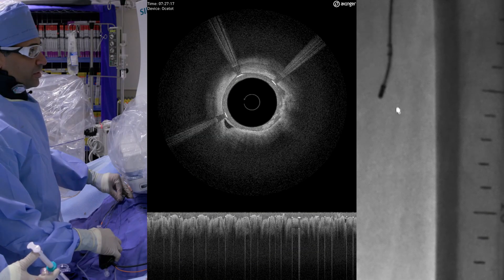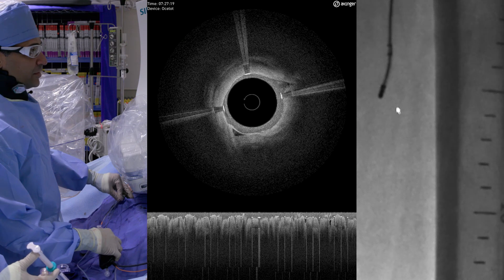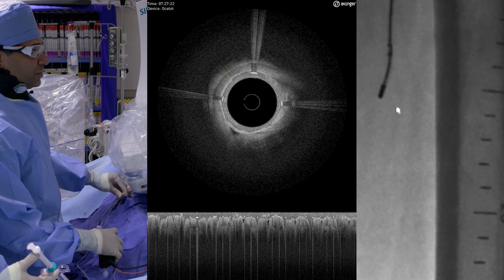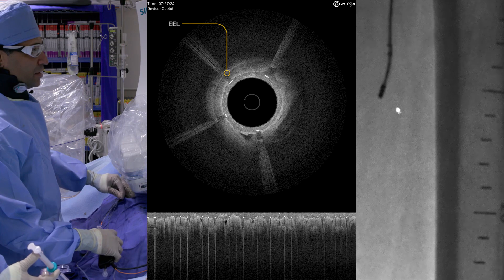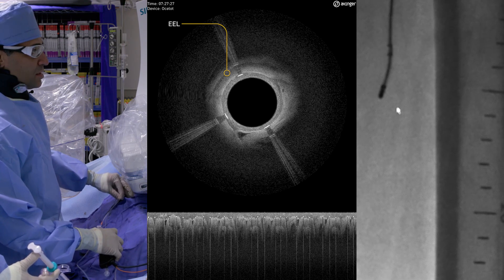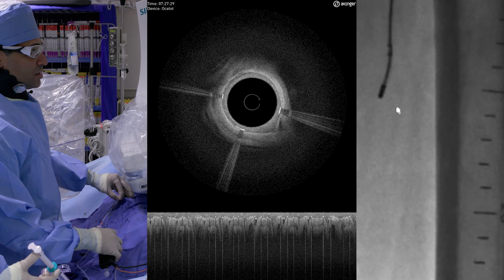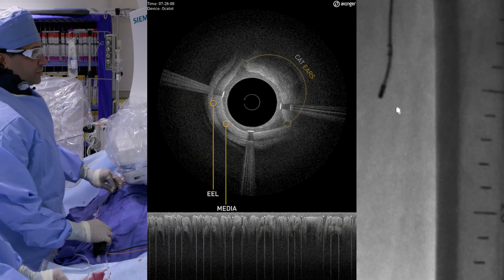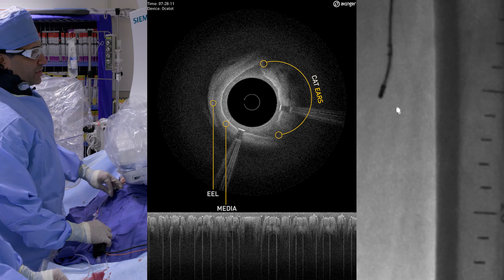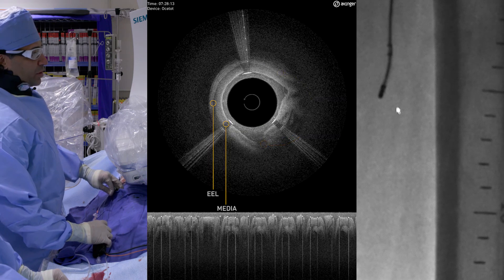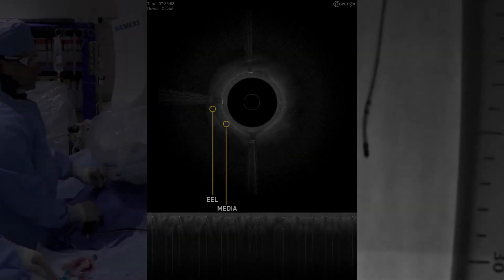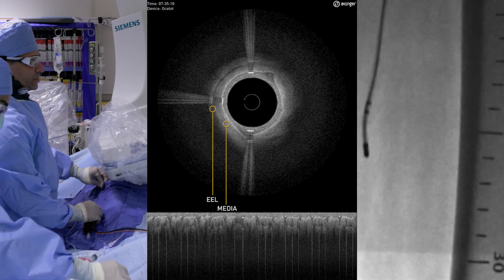And I'm slowly advancing. There's our line there at 9 to 12. I want to keep away from that. That's a beautiful example of your EEL. You want to stay away from that. So I'm putting my middle marker on top of that. Great layers there.